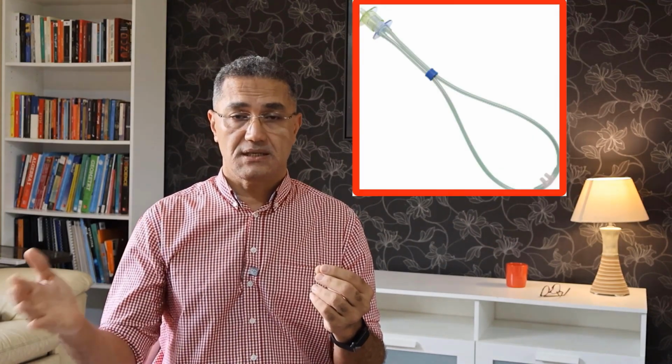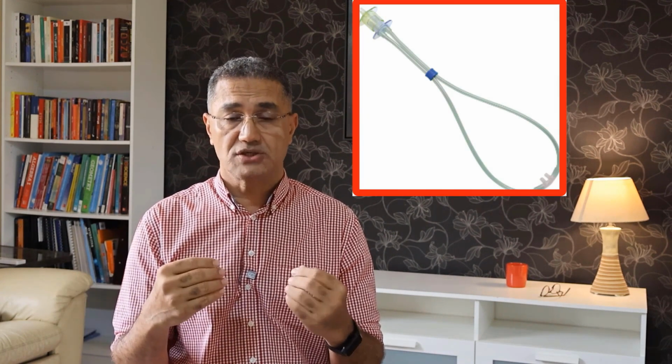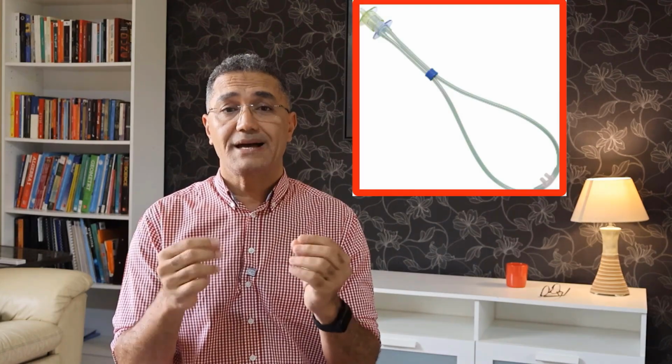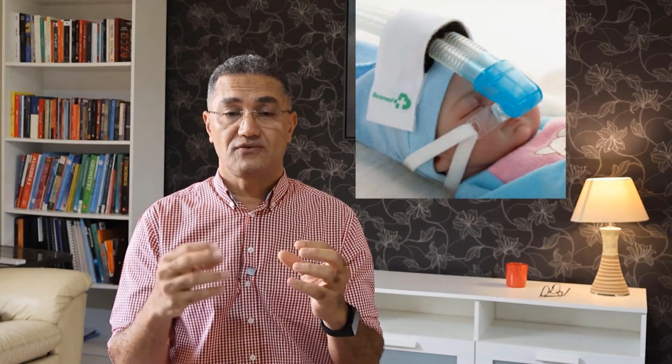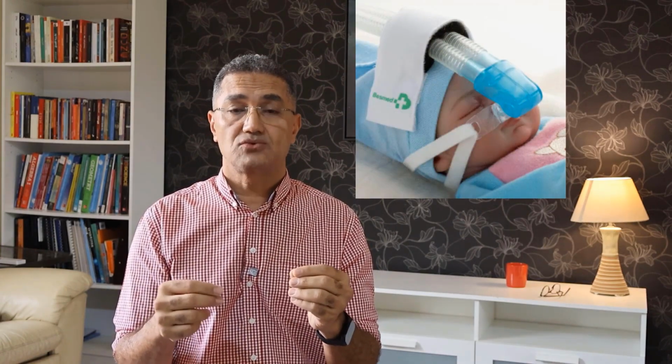The idea for the RAM cannula came from noticing that some patients, especially those who are a bit chubby or overweight, often have difficulty tolerating the standard mask used for non-invasive ventilation. The mask is a fairly large device that needs to stay on the patient's face continuously, sometimes for many hours at a time, in order to be effective. This constant use can be uncomfortable, and for some patients, it becomes intolerable. The pressure from the mask, the sensation of being enclosed, and the need to keep it on all the time can lead to significant discomfort and even anxiety.